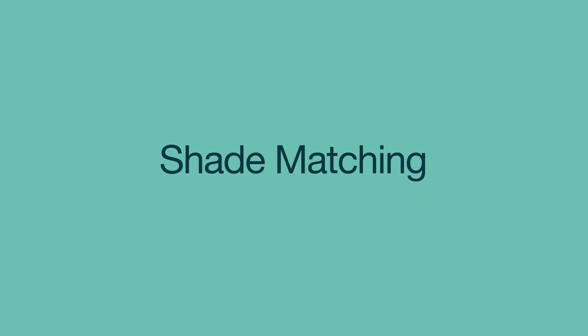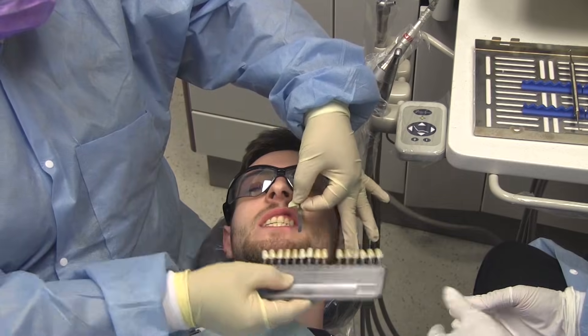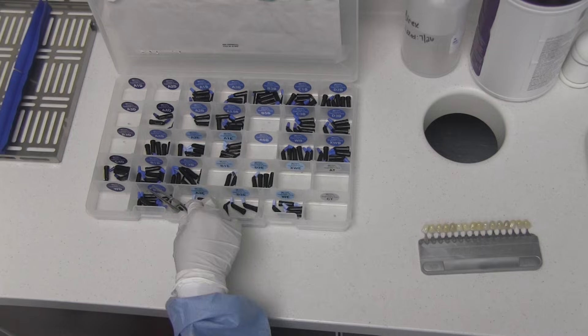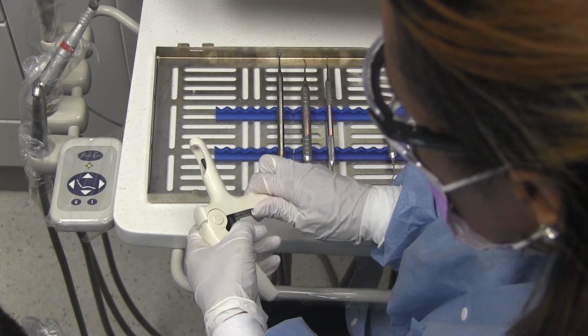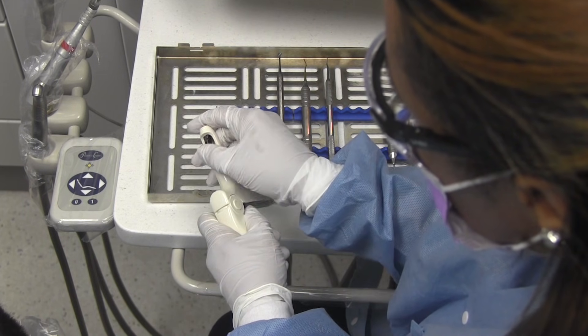The first step in a composite restoration is to choose the composite resin color shade. Pick up the shade guide and hand it to the dentist for selection of the shade that matches closest to the patient's natural teeth. Next, select the appropriate composite resin syringe or composite resin carpule of the desired shade, load the composite into the composite gun, and replace the gun on the tray.